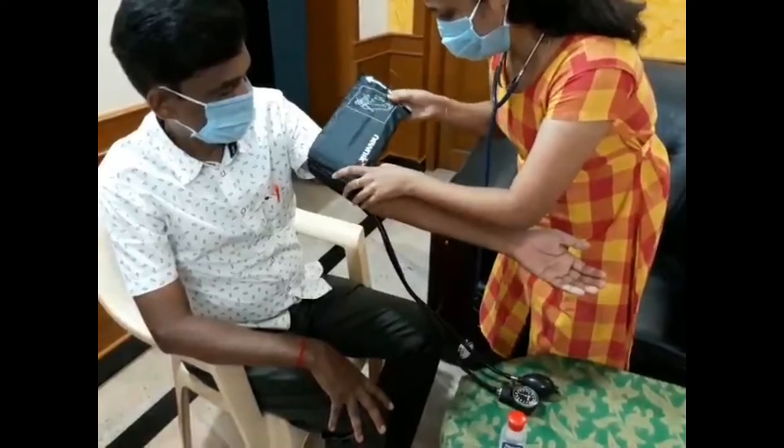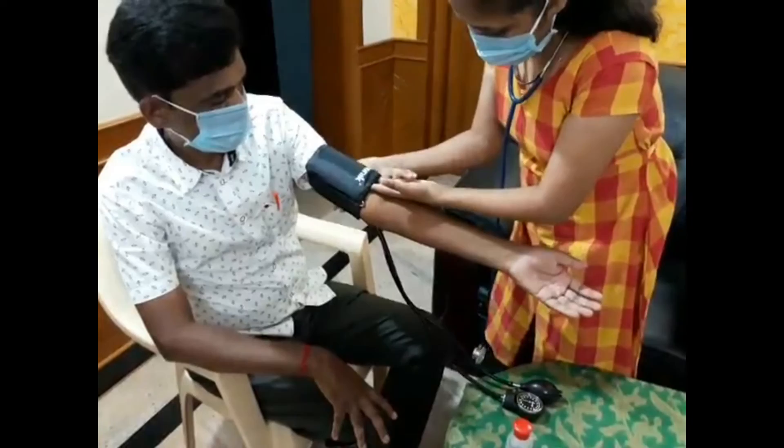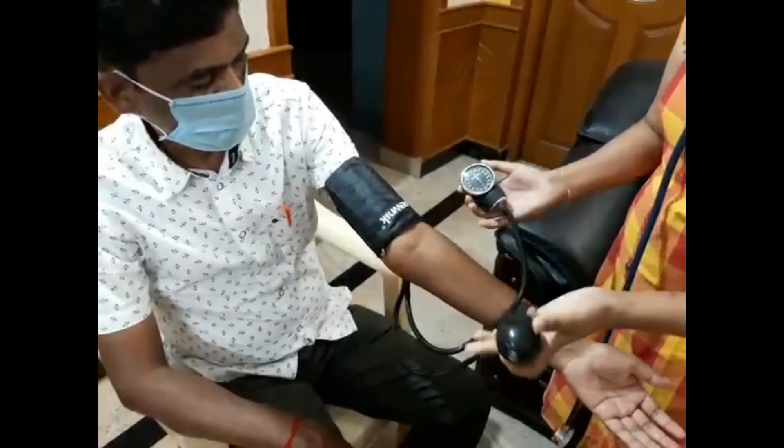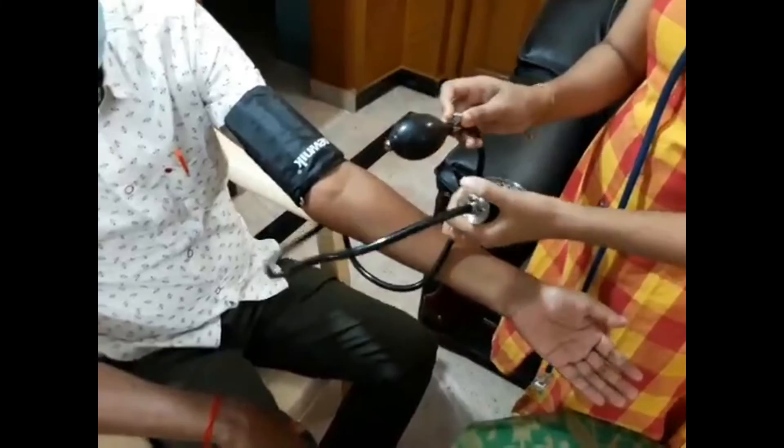This is the elbow crease. Don't make the cuff too tight. Make sure that the cuff has an appropriate size for the patient. This is the manometer gauge — we can see the pressure using this needle. This is the inflation bulb, and there is an air-releasing valve. Make sure that it is tight.